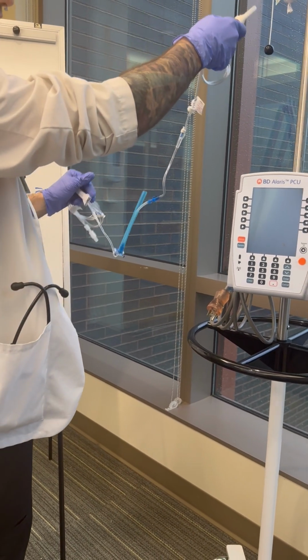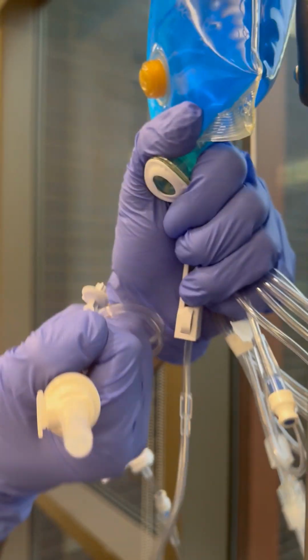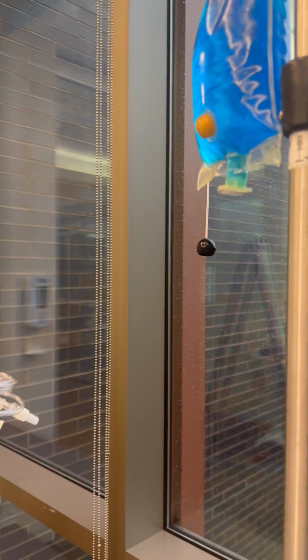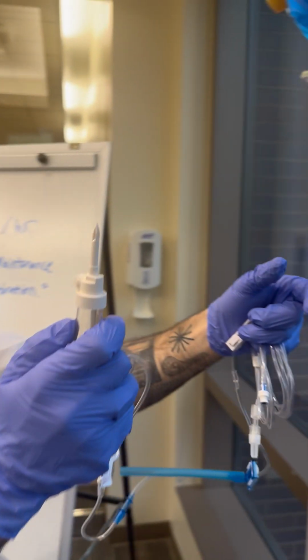I want to take this part off first on the IV bag. It's sealed, so it's not going to drip all over the floor. Let's go ahead and rip that off. Don't want to touch that. I want to keep that sterile. Same thing with the spike. As soon as you expose it, put it right in the bag, and you don't want anything touching it. So this is sterile. I want to keep it sterile.